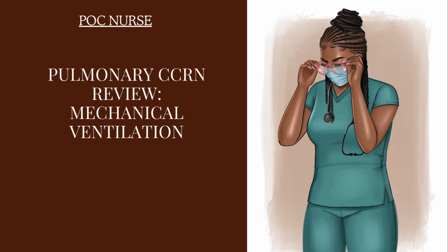So for the patient on pressure support ventilation, they have to be breathing on their own. They have to breathe on their own because if they are, for example, sedated or paralyzed, pressure support ventilation will not come on. They have to breathe on their own for the machine to now support them with some pressure.